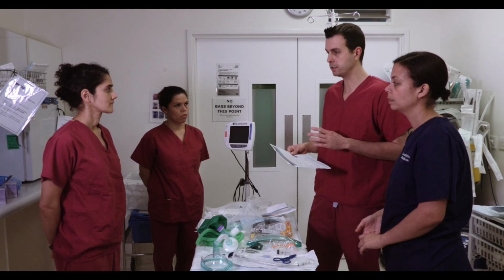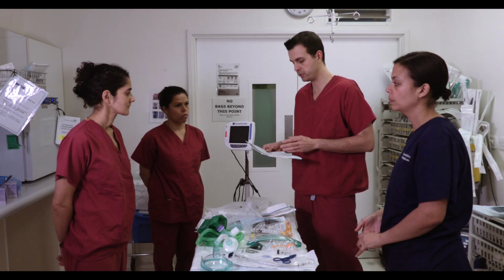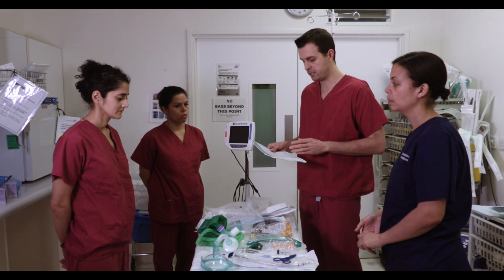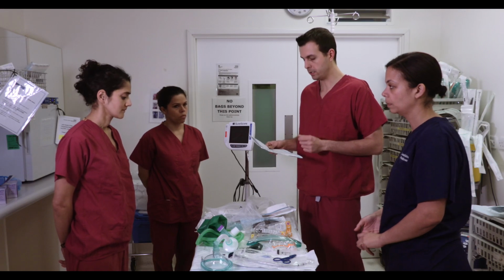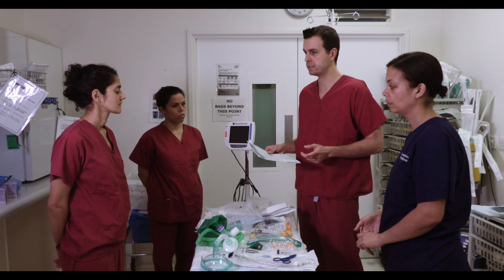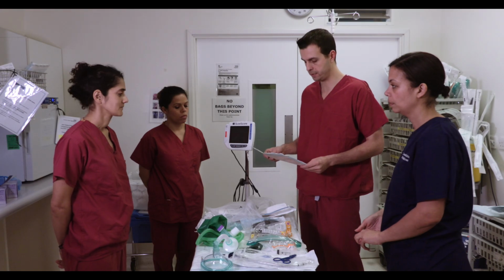And other important points is we're going to inflate the cuff before we do any sort of ventilation, if at all possible. We're going to immediately connect the HME filter, and for any sort of circuit disconnection, we're going to clamp the tube. We're going to check equal bilateral chest rise. We're going to check that with end tidal CO2 and with chest expansion. We're not going to auscultate.